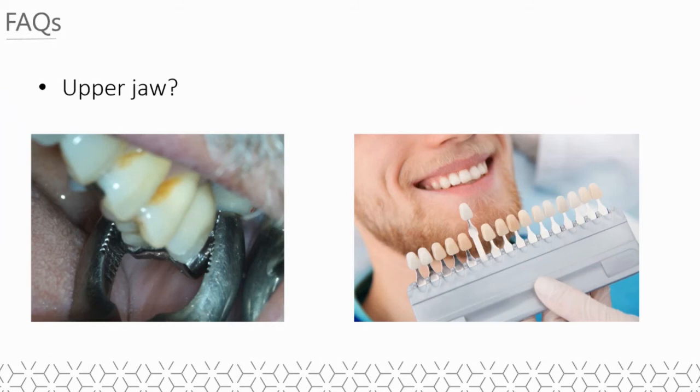The second reason is for the patient appreciation. By eliminating the palatal injections, your patients will of course be very happy. And finally, for the lack of numbness. Take again the example of placing veneers on the front teeth. A patient who is paying money for an aesthetic act will highly appreciate taking advantage immediately of their new smile, and will be certainly very open to recommending the quality of work received at the practice.